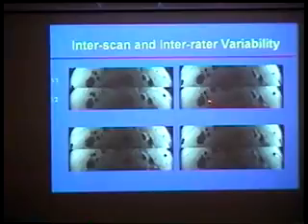What is actually interesting is if you were to measure the lumen of this diseased left carotid, where my pointer is pointing, and then measure the internal carotid on the right side, which is almost completely normal, the lumen size is almost identical in these two cases. But look at this here, the plaque buildup is fairly extensive already.